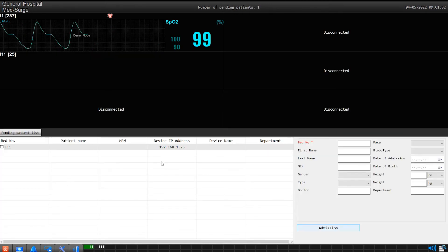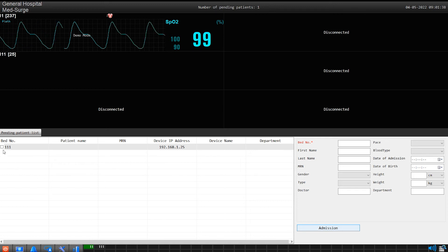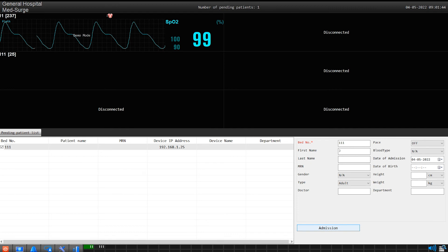You are currently on the admissions page. Now find the bedside monitor you wish to admit in the list and place a check mark in the box beside it. Then fill in the patient's information in the field boxes provided. When everything looks good and correct, click on the admission button.